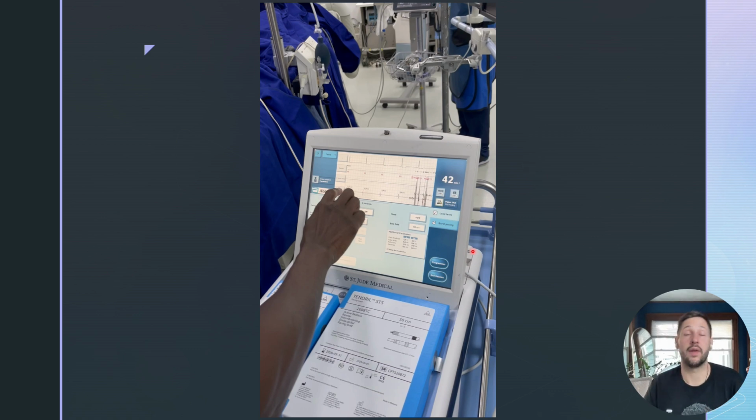So we hit save threshold on that screen, and that immediately kicks it up to 5 volts to ensure that you have capture, and that means that, to me, everything indicates it's a good lead placement, right? The impedance is good, injury current is good, sensing is great, everything looks fantastic. Nothing to indicate we should move the lead. But I think this is a textbook way of walking through the PSA. And we'll go through it one more time here at the end.